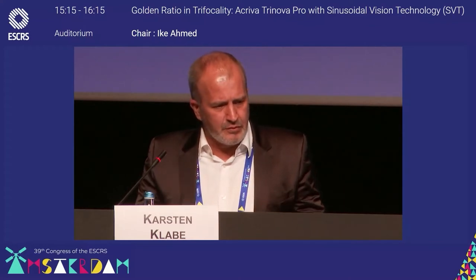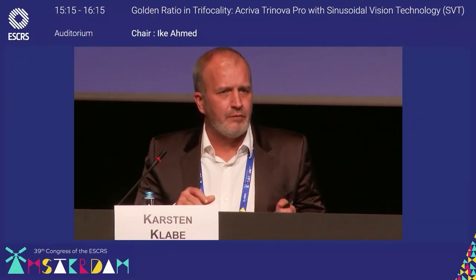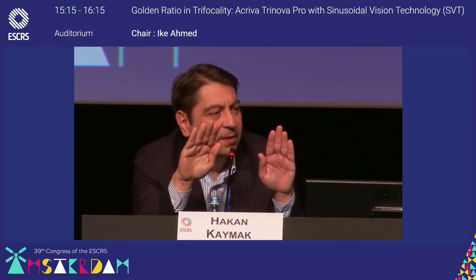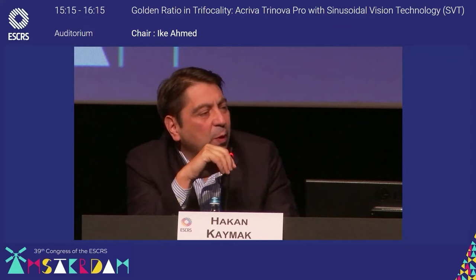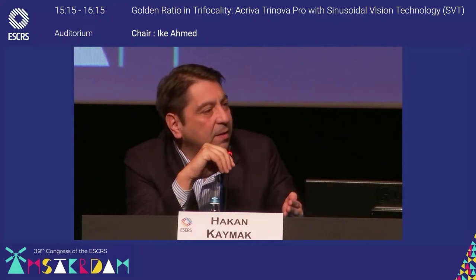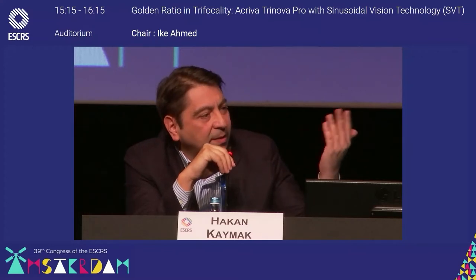With the excellent light transmission you have seen here, I think both eyes trifocal is much better for spectacle independence at all distances. And you also have this binocular summation. I think that's really something important to know. You have an improvement in the visual quality when you put this lens in both eyes. If you ask whether it is a mistake to use one multifocal IOL and the other a monofocal, then the answer is clear: no. The brain is really open. It's an open mind for all these things, so it's no problem for the adaptation.